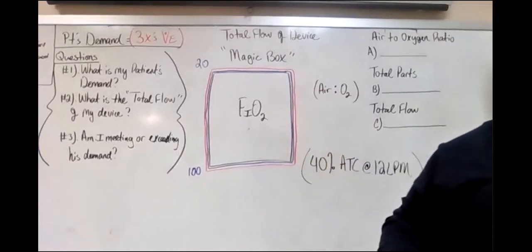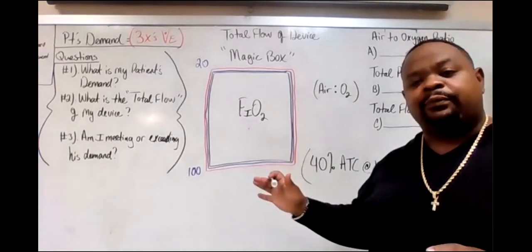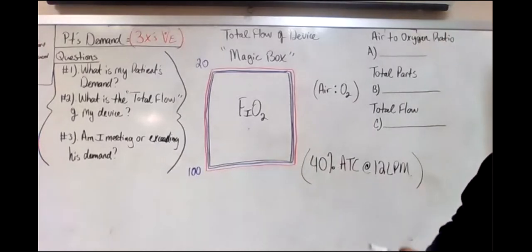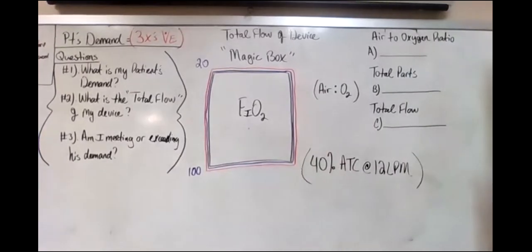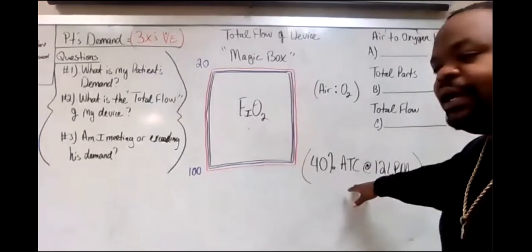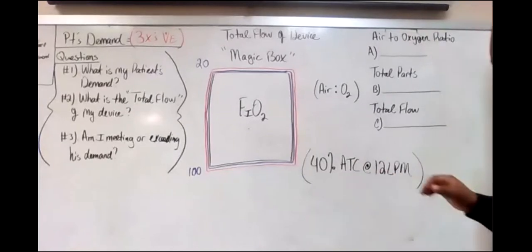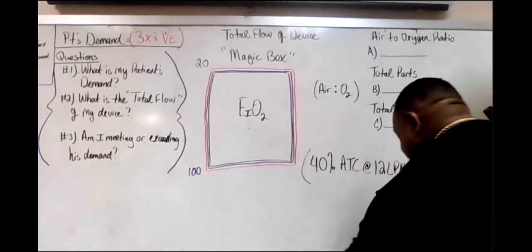Okay. And like I said, I'll show you on this mannequin once we do a couple and you understand the math. Then I'll show you the device. This is what he's on. I need to know whether this is meeting or exceeding his demand. Okay, so let me write it over here so I can have more space to play with.